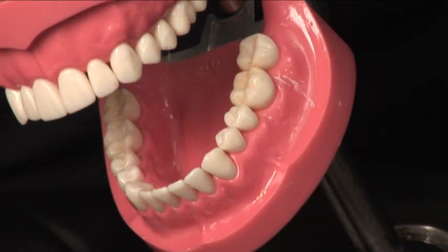Today what we're going to work on is fitting an orthodontic band on a molar. The bands come in many sizes, and you have to find the size to fit the tooth, exactly like you'd have to find a pair of shoes to fit your foot.